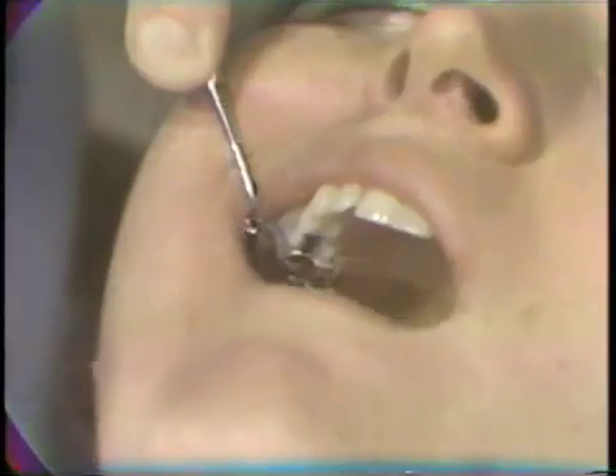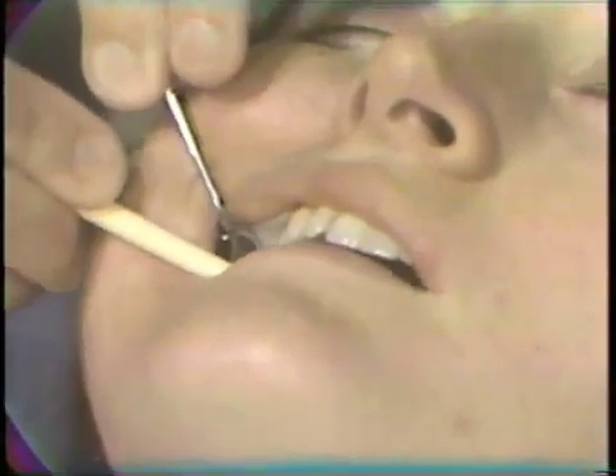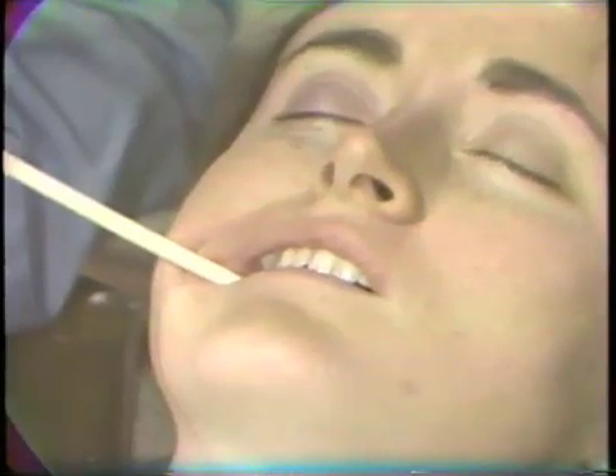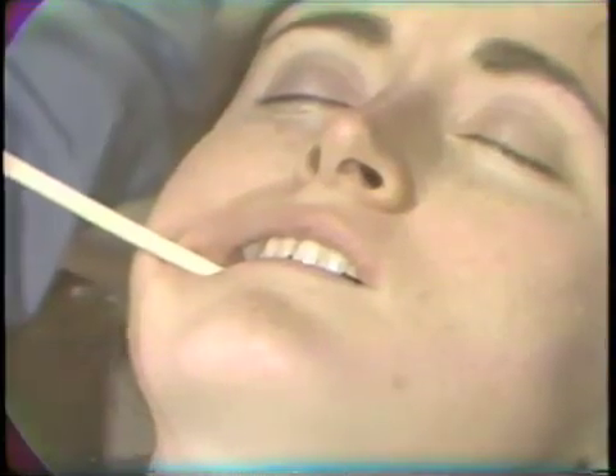The purpose of this burnishing at this stage is to close the fine gold marginal areas against the tooth — those areas which have been developed to a fineness and thinness that may be displaced due to the hydrostatic pressure of the cement being exuded from the cavity during the compression of the casting onto the tooth.